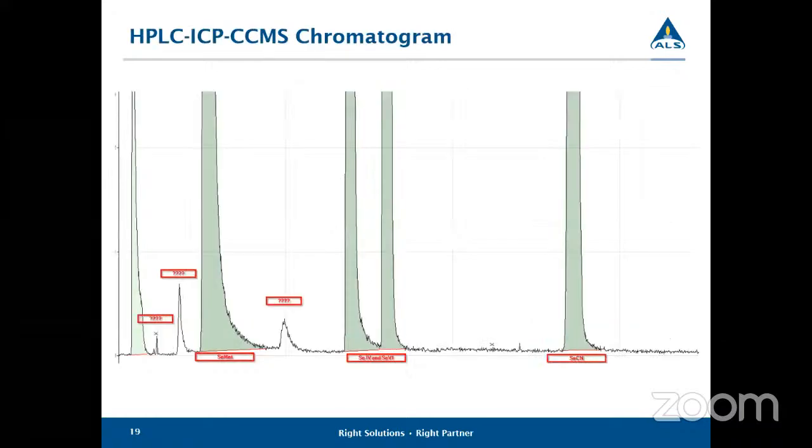But another wastewater can have even more species. In this example, there's a very large selenomethionine, very large selenocyanate, inorganic species, as well as at least 3 other unknown species. And these by far are not the worst kind of samples we see, as depending on what the process is, we're testing what the wastewater is. If it's part of a treatment process, things get a lot noisier.